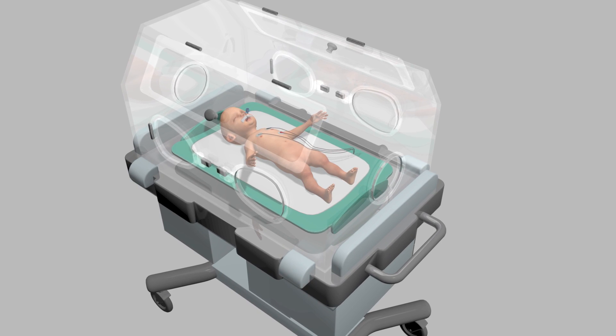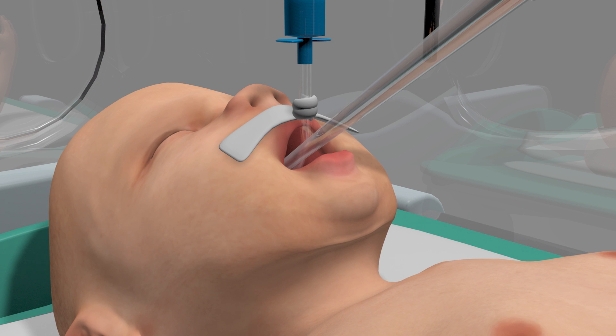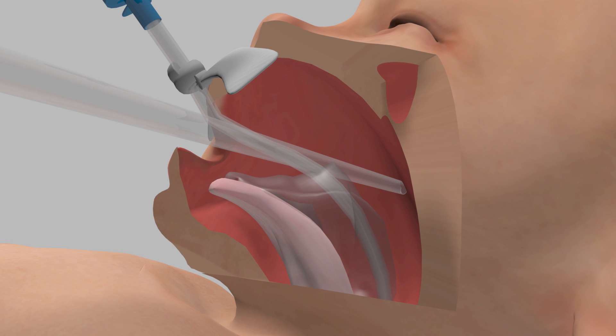Let's look at how a traditional suction system works. The one-hole tube is inserted in the mouth, suction already pulling at the baby's sensitive oral cavity. Then the tube accidentally goes too far and it hits the back of the throat, tearing off a piece of tissue, causing trauma.